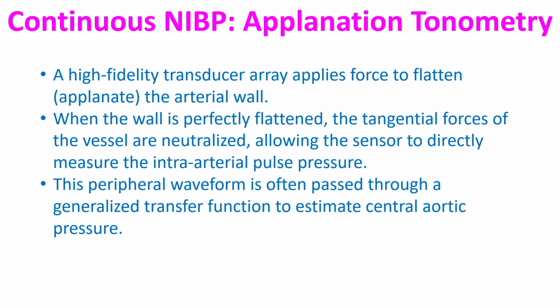applanate, the arterial wall. When the wall is perfectly flattened, the tangential forces of the vessel are neutralized, allowing the sensor to directly measure the intra-arterial pulse pressure. This peripheral waveform is often passed through a generalized transfer function to estimate central aortic pressure.